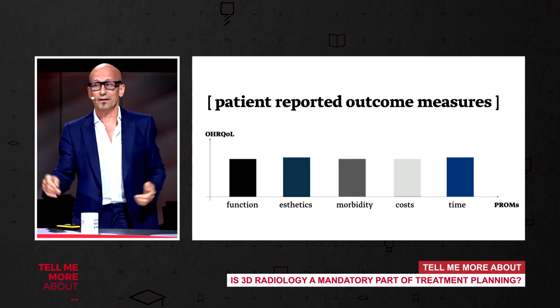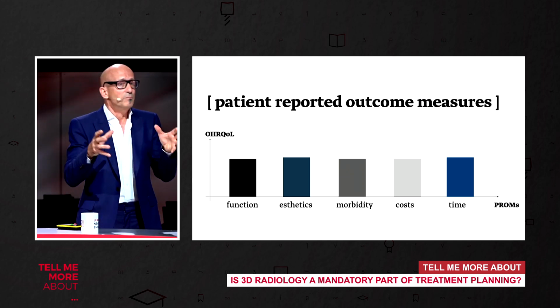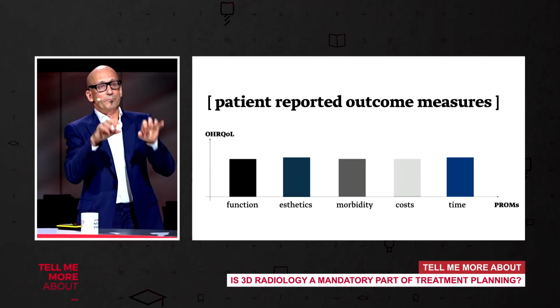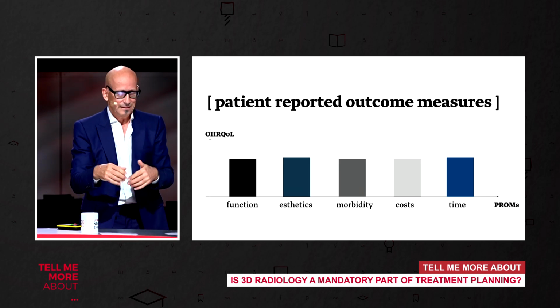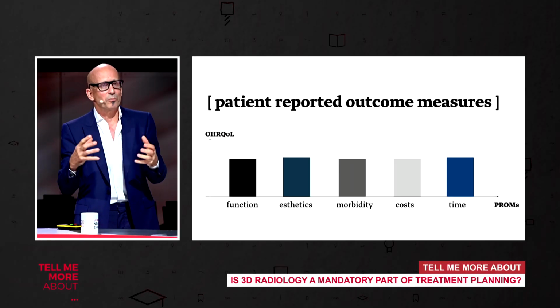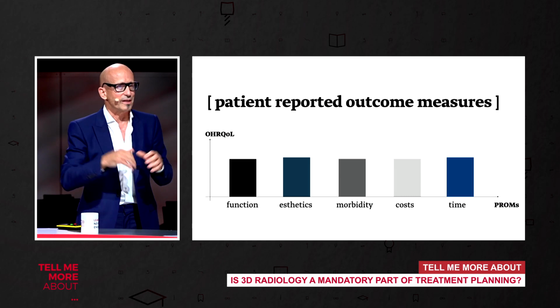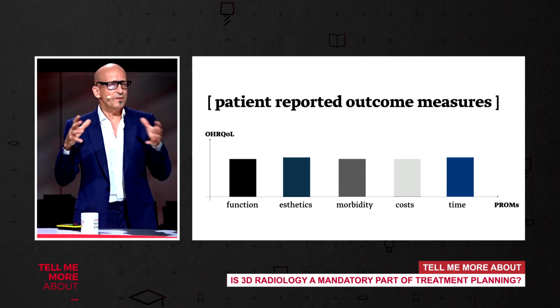And this is what you also can see in medicine everywhere. By being more navigated, understanding better the site you are going to treat, you can do it more minimally invasive, more predictable, and I think it's not going to stop. But at the end, I don't want to say that for each implant we need navigation now. This depends, in my opinion, also on the clinical experience. If somebody is really a beginner, I would always recommend it. Honestly, even though I placed my first implant over 30 years ago, and I have experience, I like to have navigation. I like to have at least a template, a static navigation.